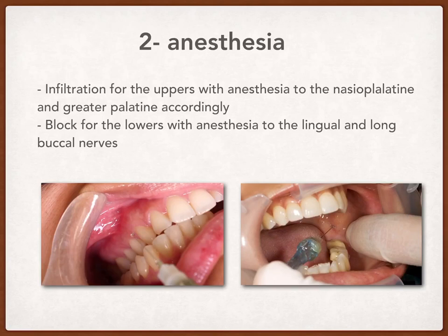If you now insert your index finger in your buccal vestibule, upper buccal vestibule, you will feel that piece of the zygomatic bone that is above the maxillary 6 or maxillary first molar.